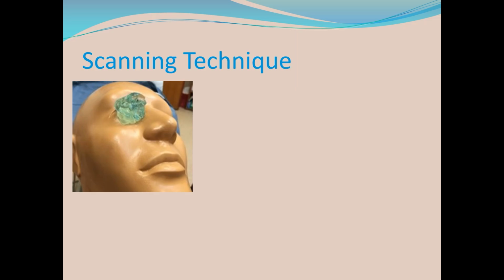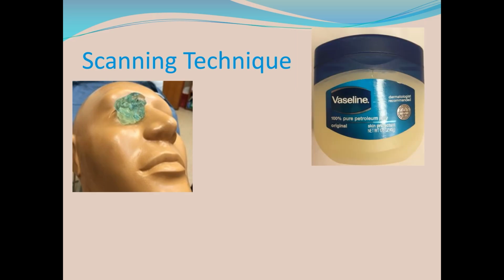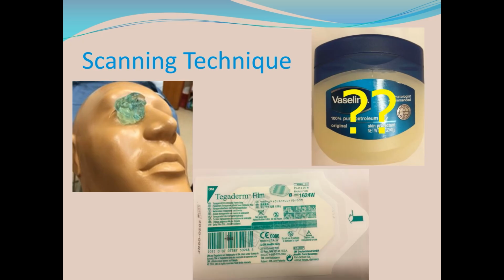And you can use ultrasound gel if it's a nice high-quality gel that's not going to run all over the face. Some people have also used Vaseline because it's pretty gooey. It doesn't run down the face very much. And some people use a Tegaderm over the eye. So they firmly place the Tegaderm and then they put the gel on top of it. I personally have a hard time with that. I tend to get air under the Tegaderm, and as you know, trying to see through air is somewhat difficult. So I do not use a Tegaderm. I talk to the patients and tell them what I'm going to do, and then I put the gel right on the eye. And you might want to have them take out contact lenses if they are wearing them at the time you're taking a look.